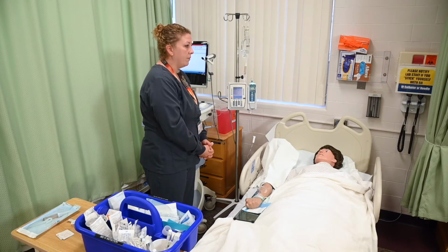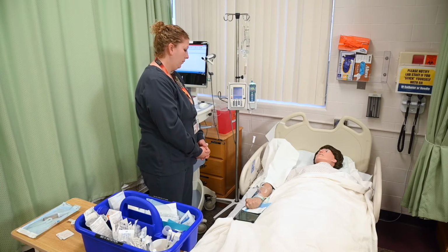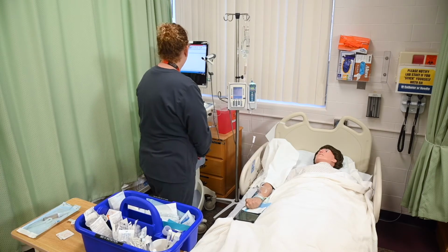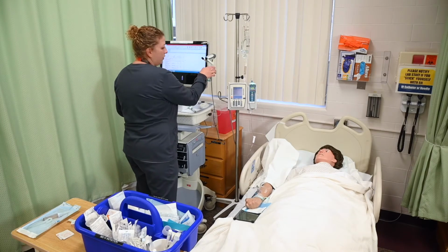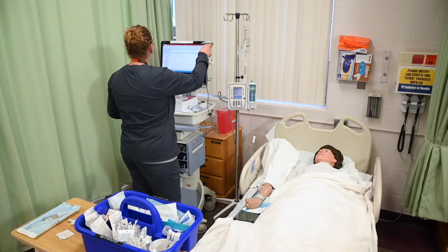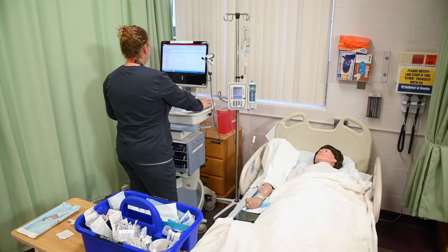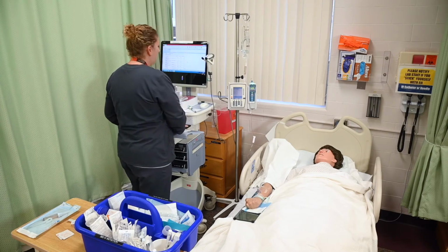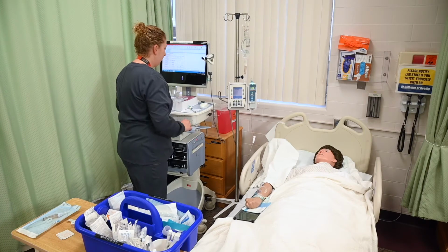There's no family present. Identify the patient using 2 patient identifiers. Compare with the MAR or medical record and scan the patient. Can you tell me your name and date of birth? Great, thank you. Verify patient allergies. And do you have any allergies? Okay, that won't affect our procedure today.